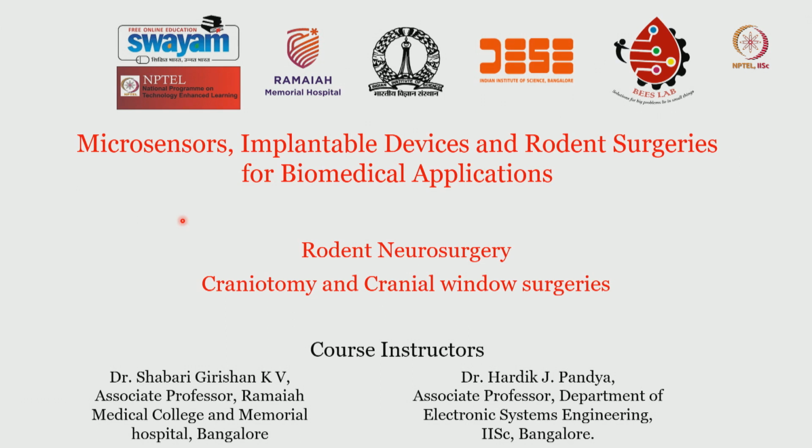So the aim is that you will be able to handle the craniotomy as well as the stereotactic techniques and then customize it as per your need. So today's session is entirely on the craniotomy and cranial window surgeries.